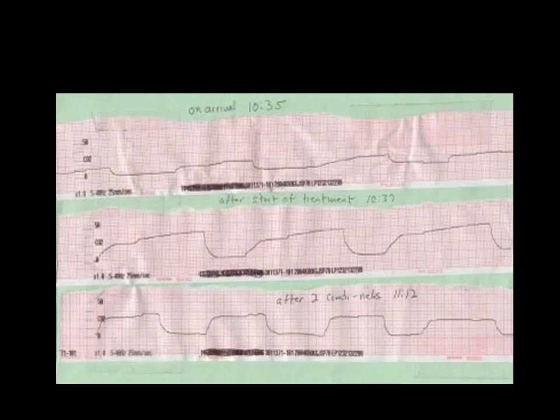This is another example from an internet case where you see they're so tight. They have an asthma situation where they're so tight they're not moving any air. So even though we talked about the patient hypoventilating, they're hypoventilating to the point now where they're not getting any carbon dioxide out.